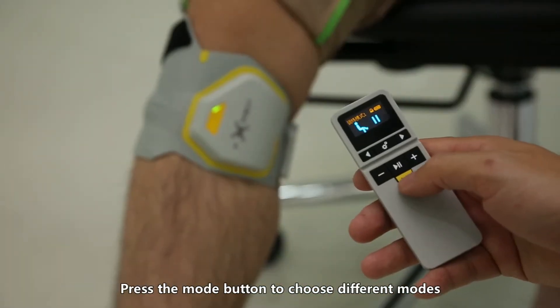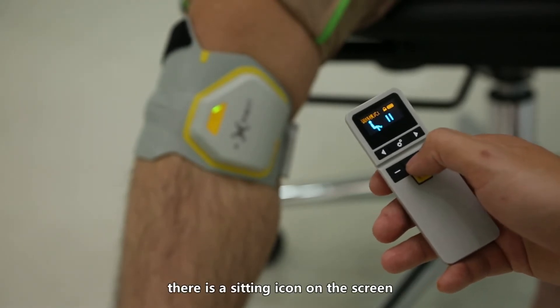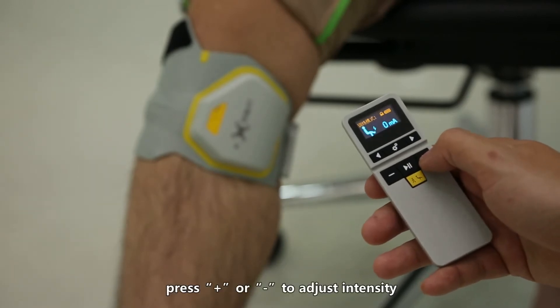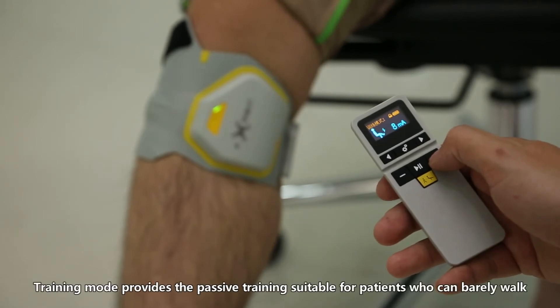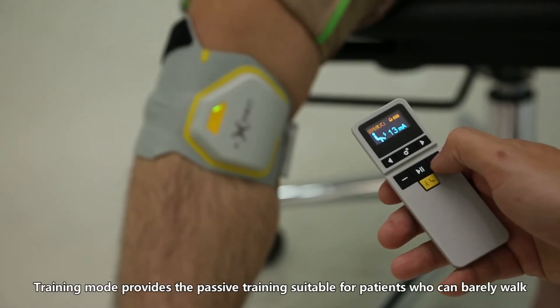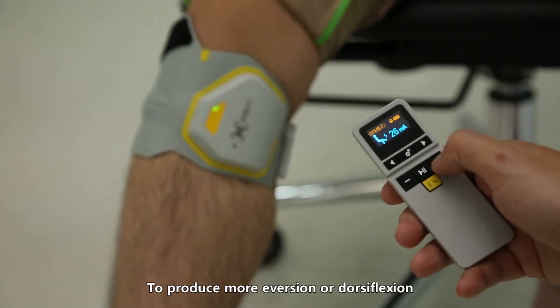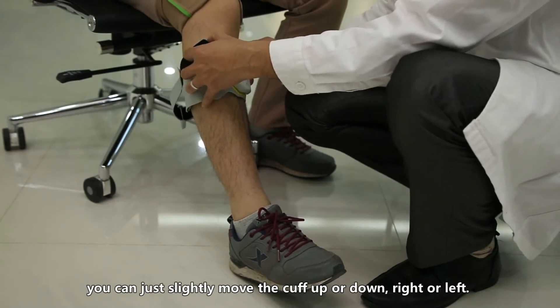Press the mode button to choose different modes. In training mode, there is a sitting icon on the screen. Press the play/pause button to start training mode, then press plus or minus to adjust intensity. Training mode provides passive training, suitable for patients who can barely walk. To produce more eversion or dorsiflexion, you can slightly move the cuff up or down, right or left.